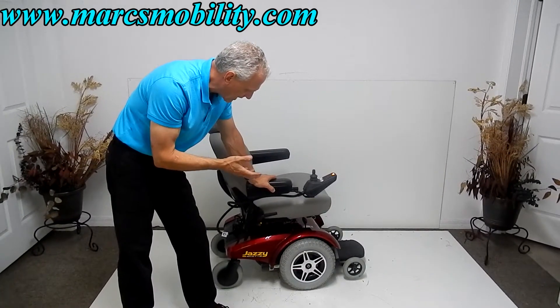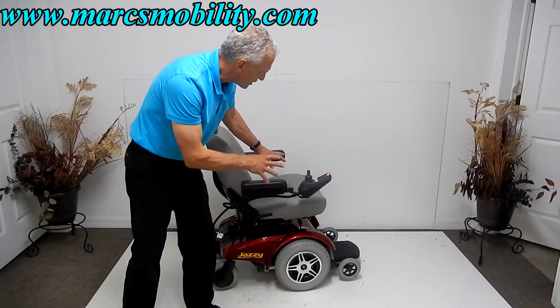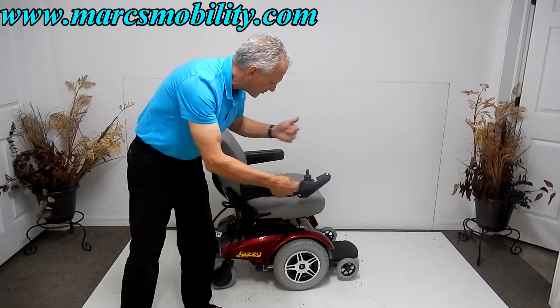I particularly like this chair a lot because it's a front wheel drive chair with great suspension. When you're sitting in the chair, all your weight is on the wheels, so you're getting a lot of good traction outside.